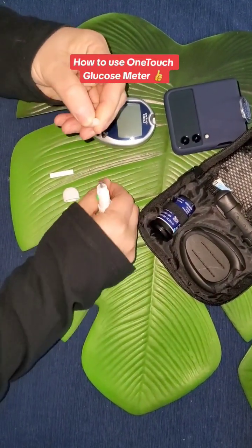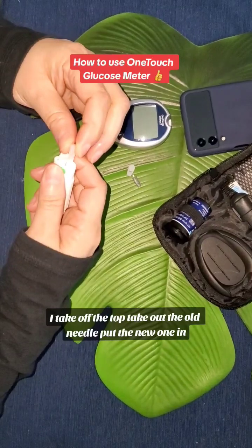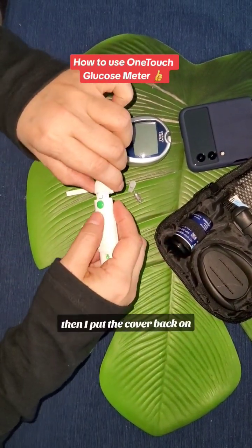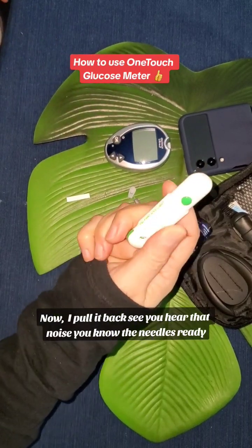Here is the needle. I take off the top, take out the old needle, and put the new one in. Then I put the cover back on and secure it into place.